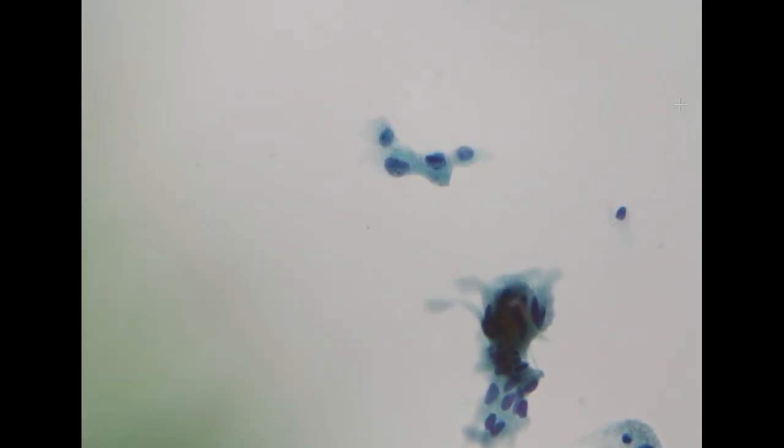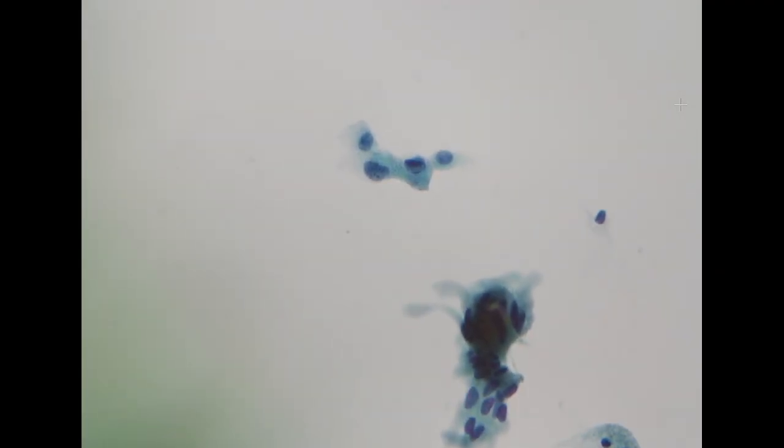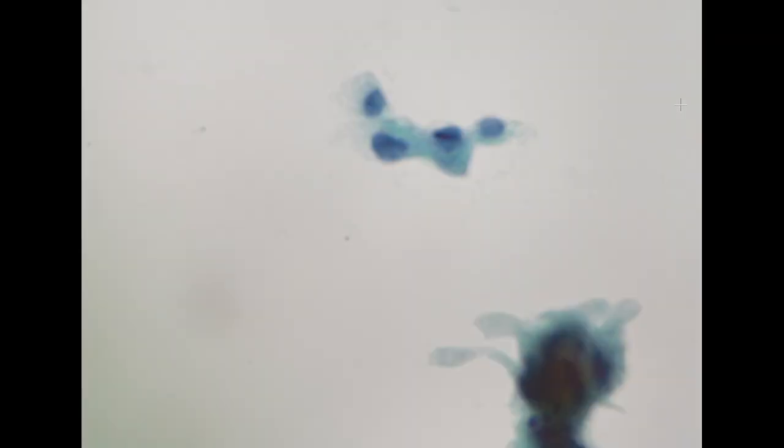So for this area, this looks more convincing because of the nuclear atypia. The cells are not smooth, with angulation and variation in size. The arrangement is also disorganized, because here you see overlapping and here you see a big gap between two nuclei. So this is more consistent with adenocarcinoma.